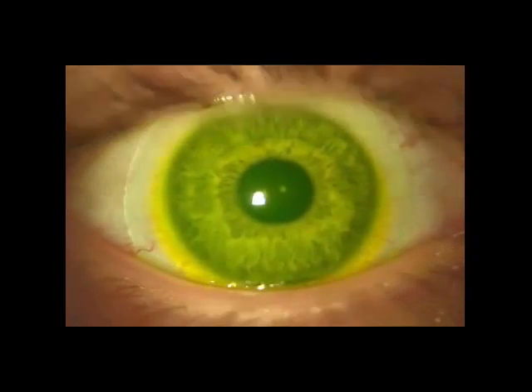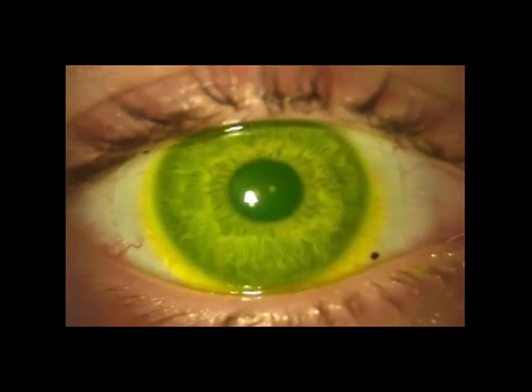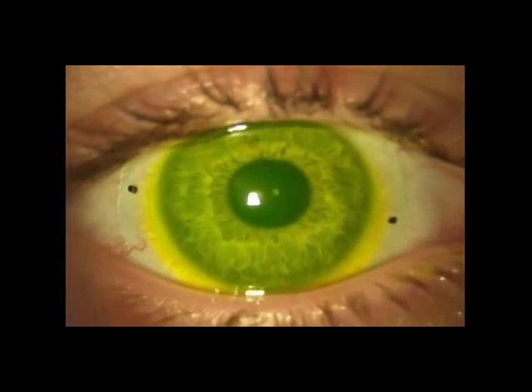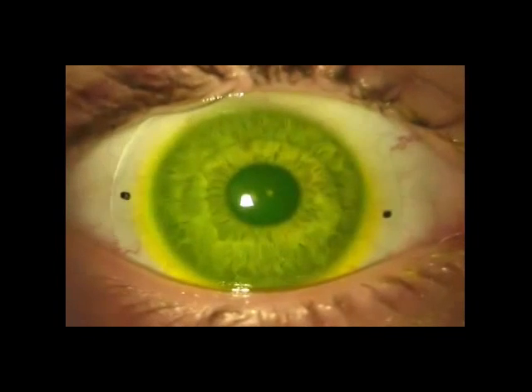As we rotate it off axis to 90 and 270 and ask the patient to blink, let's see if that lens comes back to its appropriate pre-settling axis. And notice how it's continuing with each blink to move in the direction of where it started out.